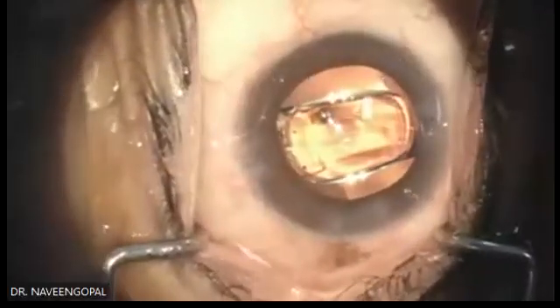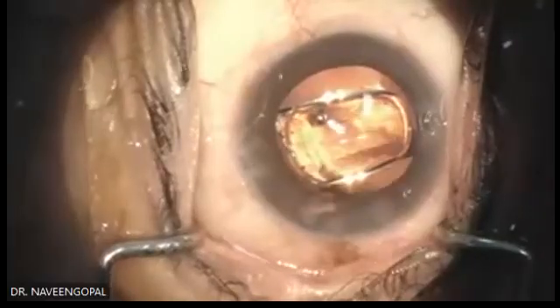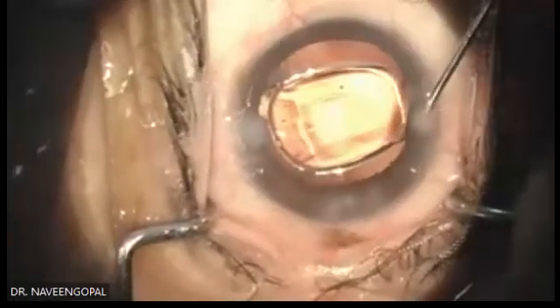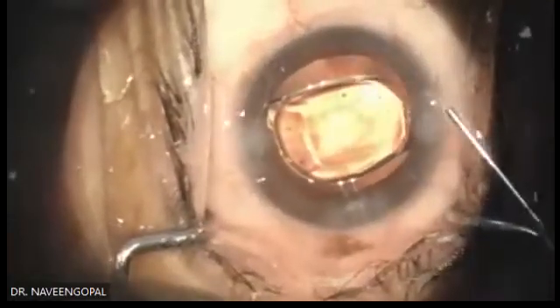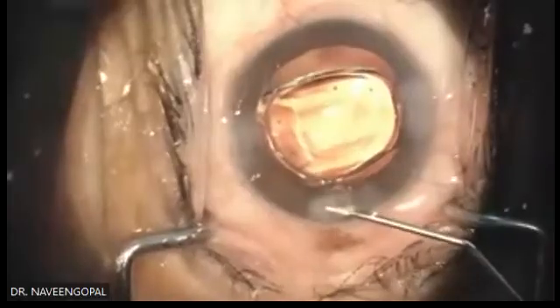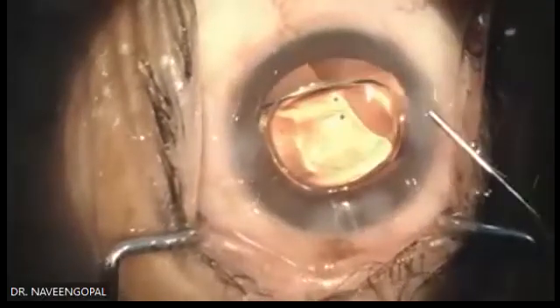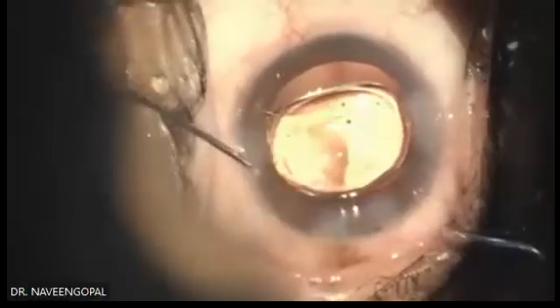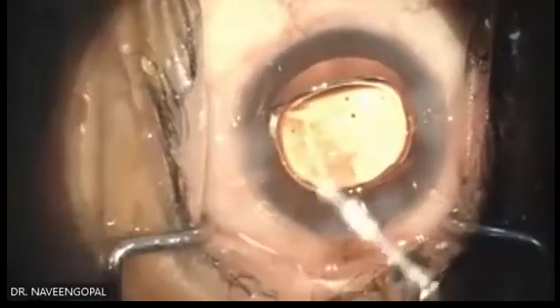Now I'm going to close. While I'm closing, I'm going to fine tune the centration. Now I'm in the coaxial mode. So it is around 6 degrees projection. Coaxial mode is around 6 degrees projection. Oblique mode is around 45 degrees. Remember that. The Purkinje images position depends on that. So remember your theory. There are 5 Purkinje images total here.